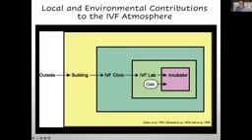So the gas was considered a concern for many years, but these newer findings showed that the outside was important, and that the building could have very high levels of VOCs, and also the IVF lab, and also the air and the incubator.